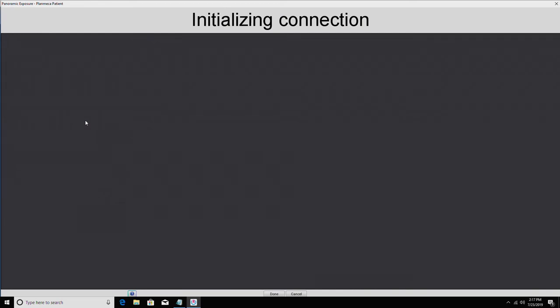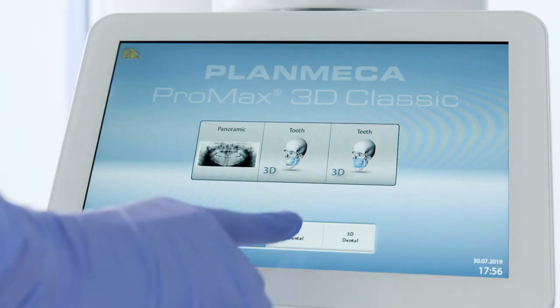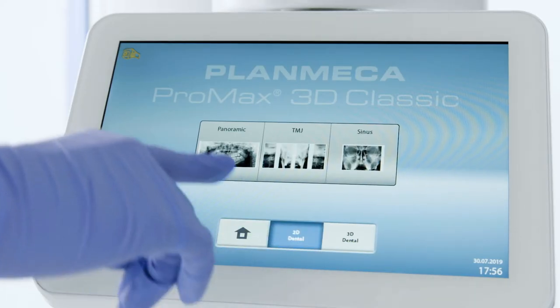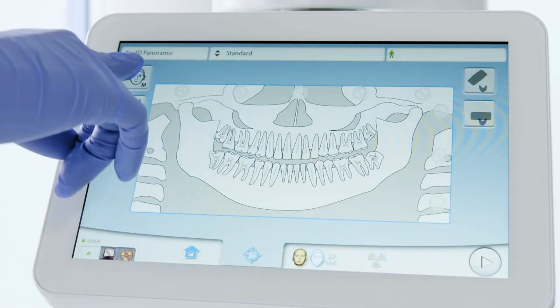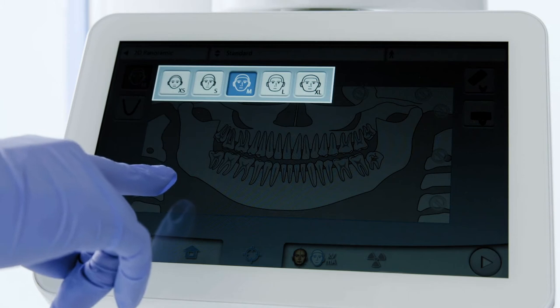Once the computer shows 'Waiting for Ready,' walk over to the touchpad on the Planmeca Pro Max X-ray unit. Select 2D Dental, then Panoramic. In the upper left of the touchpad, choose the patient's size.